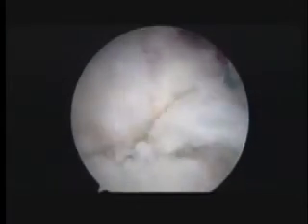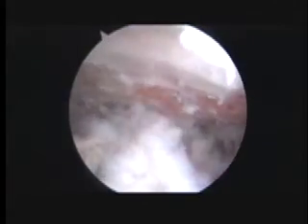And so the finished result looks something like this. We've got that hole completely repaired. As I rotate, you can kind of see the sutures. And the suture line there. And there's our biceps. Okay, so we're going to finish up here. We're going to place a pain pump catheter, and then we're going to get you back to the recovery room.